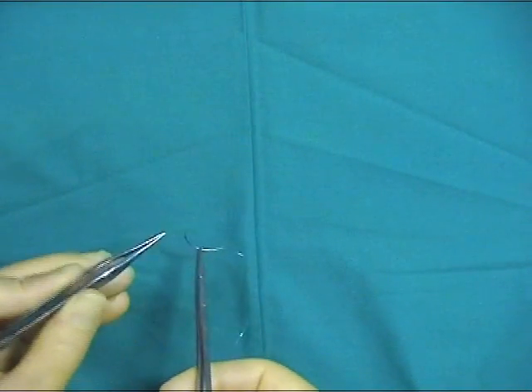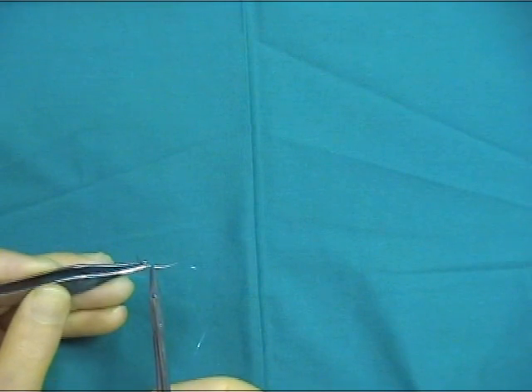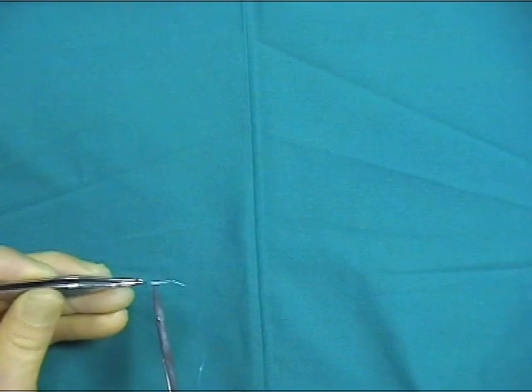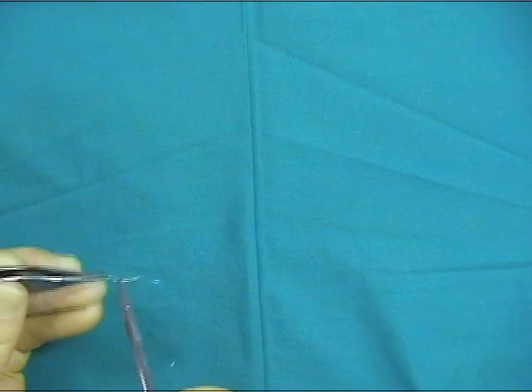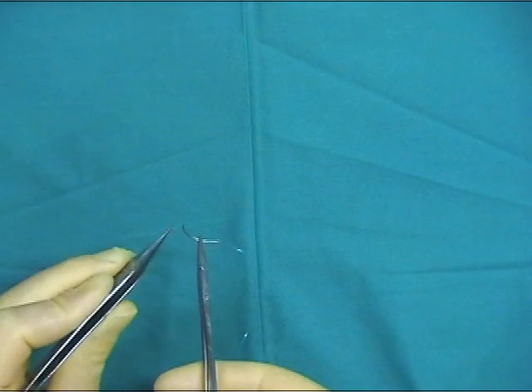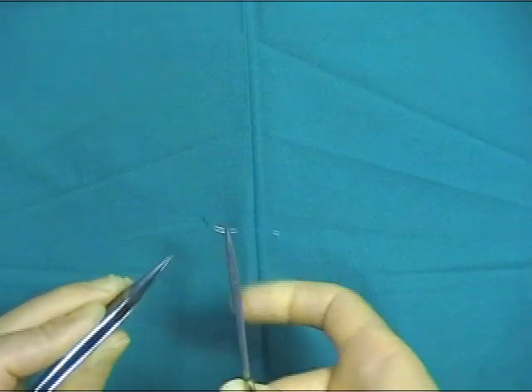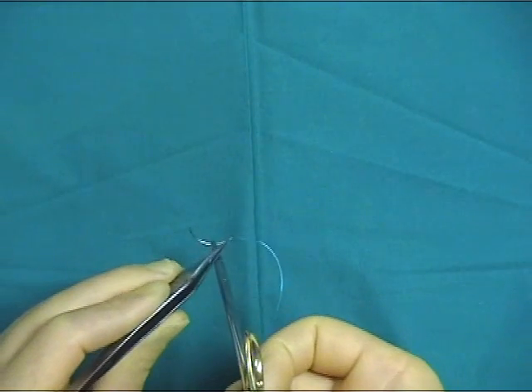The needle can either be held two-thirds away from the tip and perpendicular to the needle holder, or, when using a half-curved needle, it can be held halfway along the shaft at a slight angle, as demonstrated. It is important that the needle is grasped at the tip of the jaws of the needle holder.